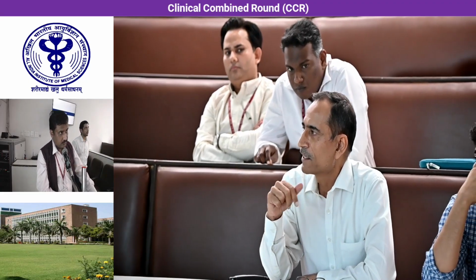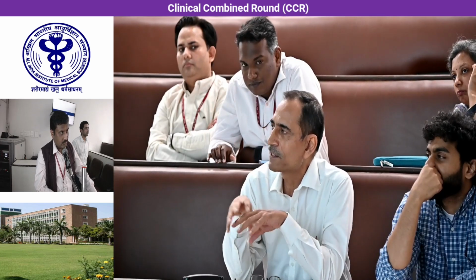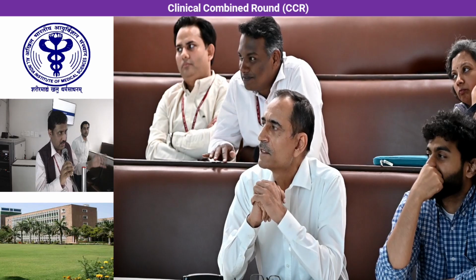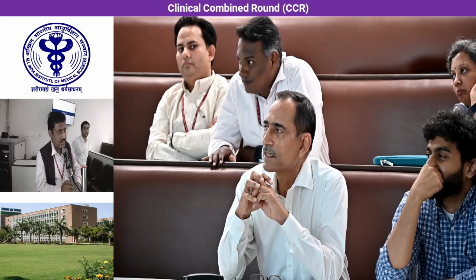Filters, infrarenal, suprarenal. Certainly, this setting is different. So, has there been any literature in which the IVC filters will take care of embolization? These actually have been discussed by multiple people, those who are doing it at international level also. Nobody routinely puts an IVC filter for IVC tumor thrombus.